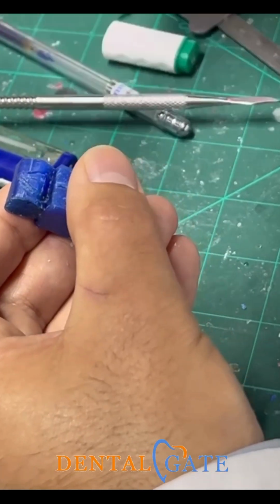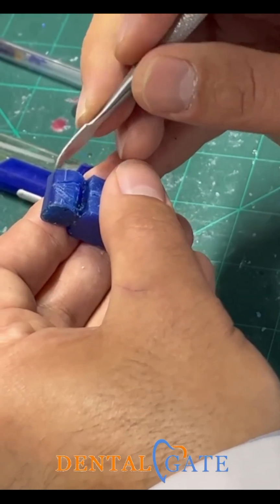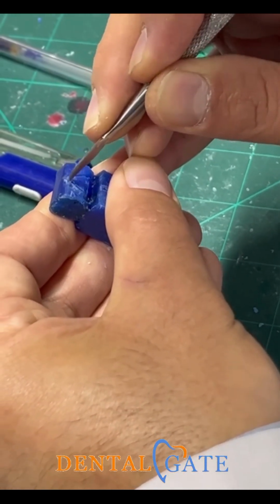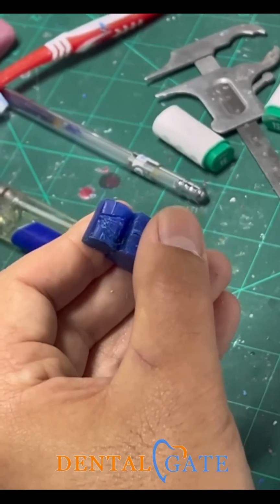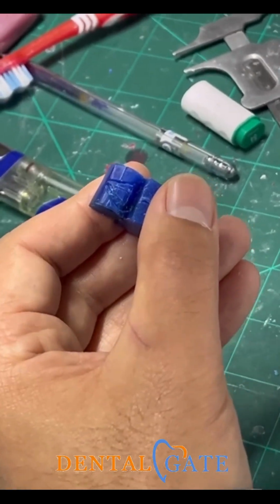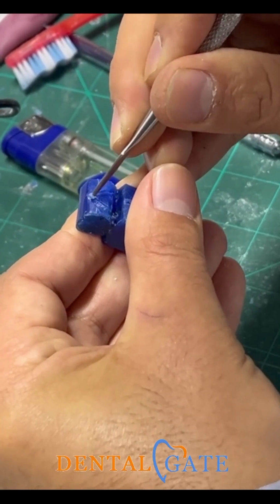Now, what do I need now? Make a cutting. Please make another check, because this is a cutback technique. I can't make any error, to avoid repeating the block. So make a final shape here.